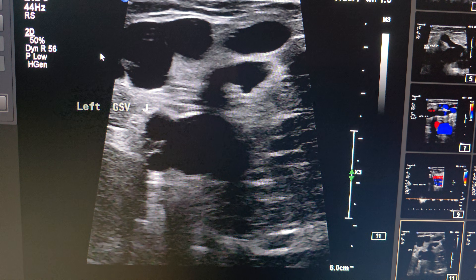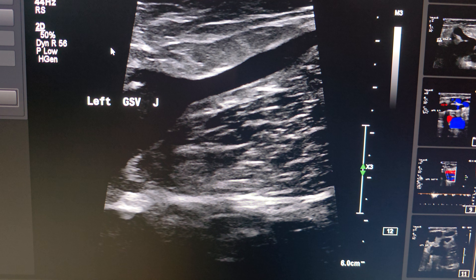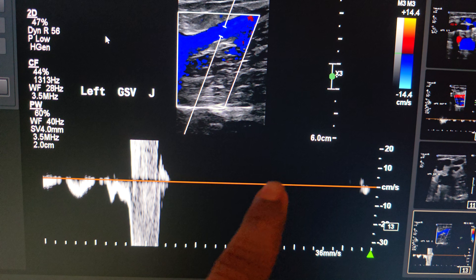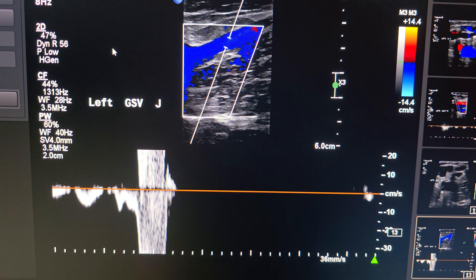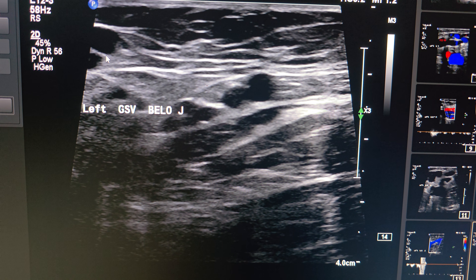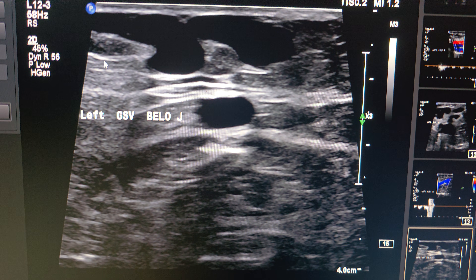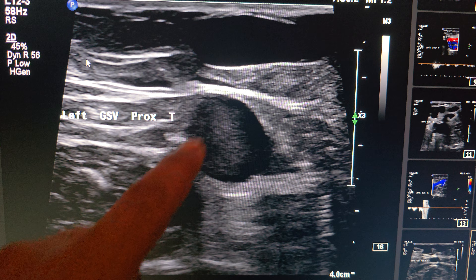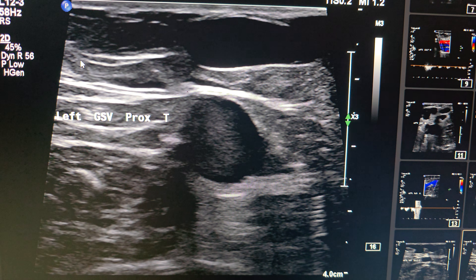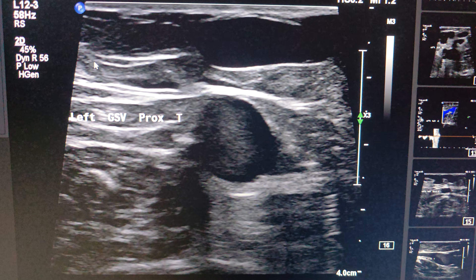Now we move to the superficial system — to the great saphenous vein at the junction. With augmentation, there was no reflux, meaning the GSV is competent at the junction. When we move near to the junction at the proximal side, we can see that the varicose vein from the groin passes toward and joins the GSV at the proximal side.